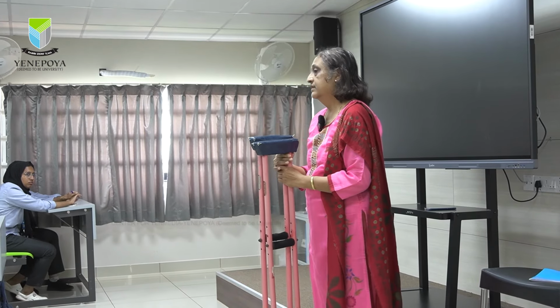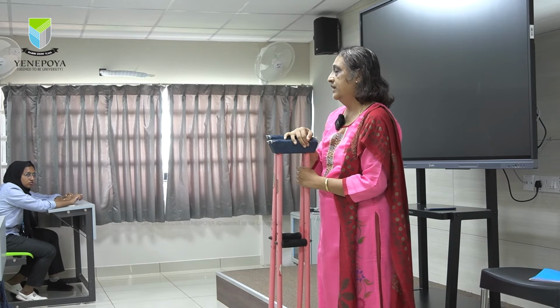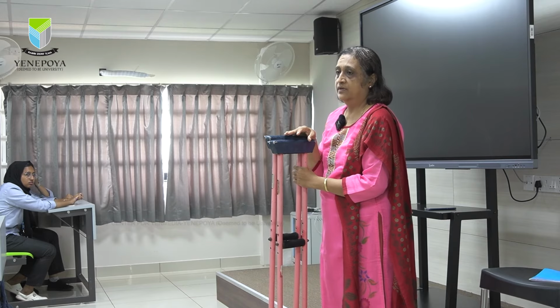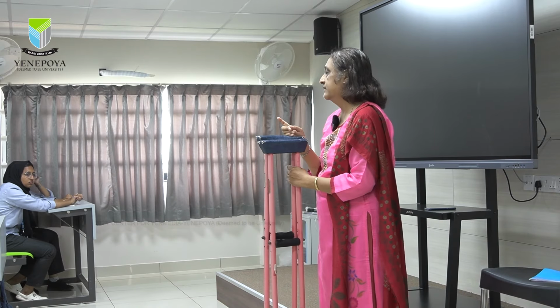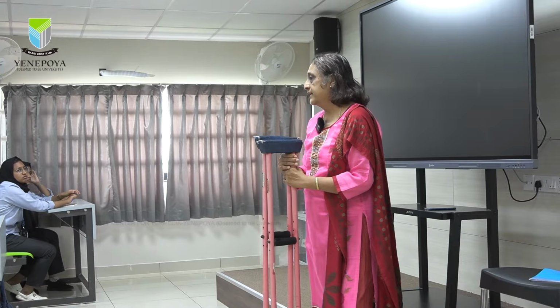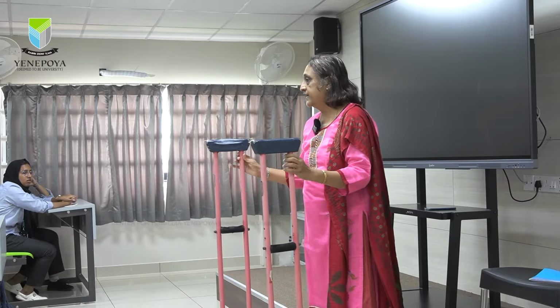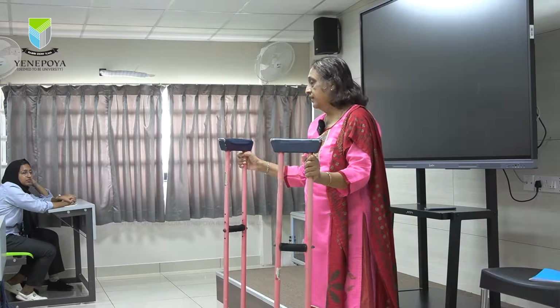First of all, check his parameters, his normal parameters which we have already talked about, that is the base of support, then the step length, stride length and the cadence. For that particular person, if you know all the parameters, it is easier for you to train the person. You are giving the mobility aids to the person to increase his base of support. The type of crutches is your choice.